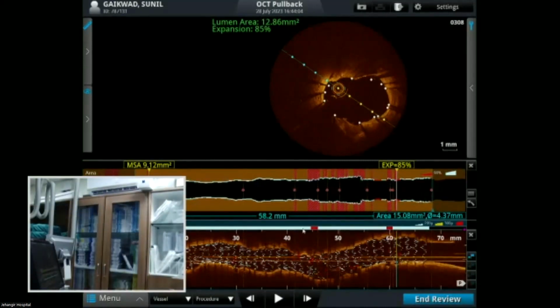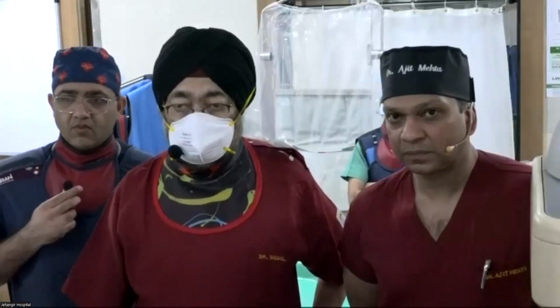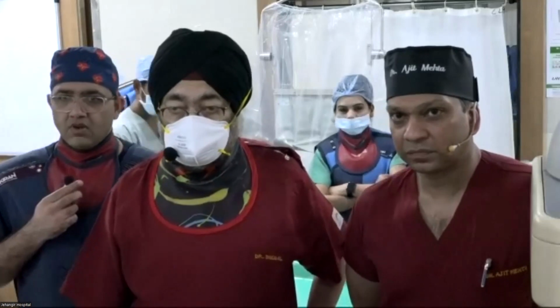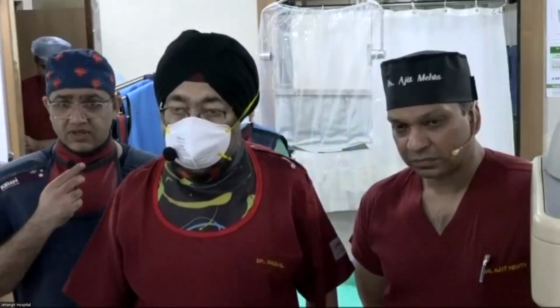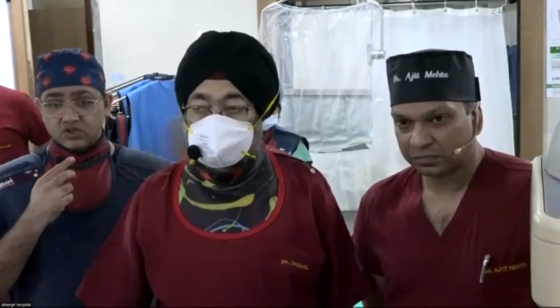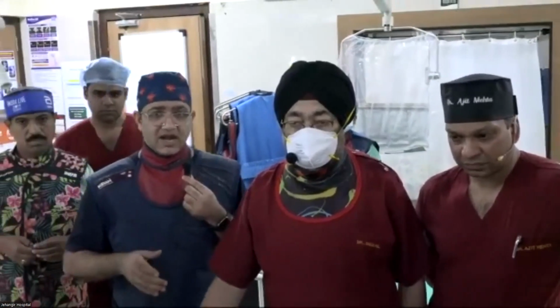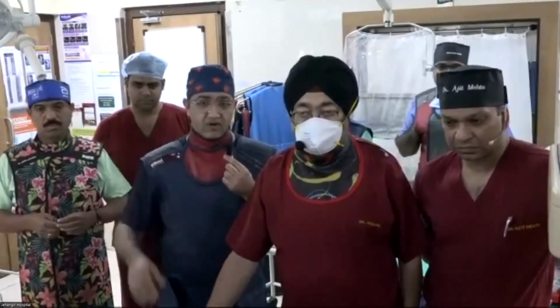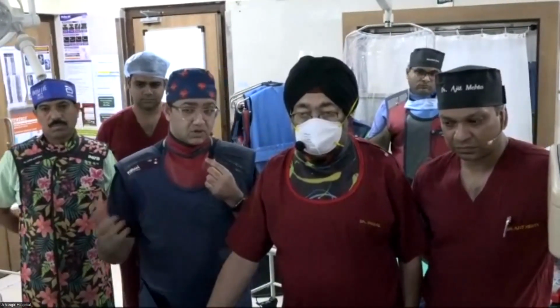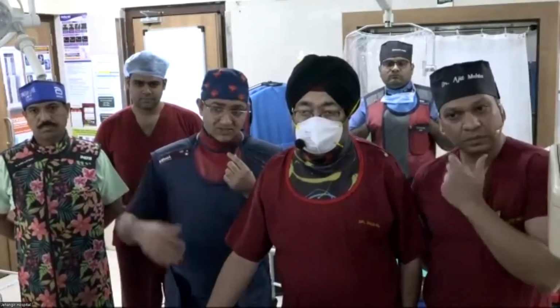Now that's a very good result. Thank you for sharing that. Very nicely done. One question, do you think an IVL would have made a difference in the proximal nodule? After the end of this case, we strongly feel that given the amount of struggle that we had with the proximal nodule and distal nodule, without the rotablation, without an ablative technique, it would not have been possible. It's not possible because the tracking profile of IVL is much bigger as compared to a non-compliant balloon, and our non-compliant balloon was not even tracking down the proximal as well as the distal.